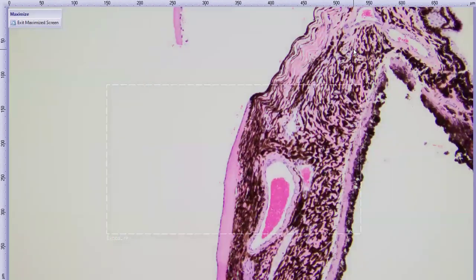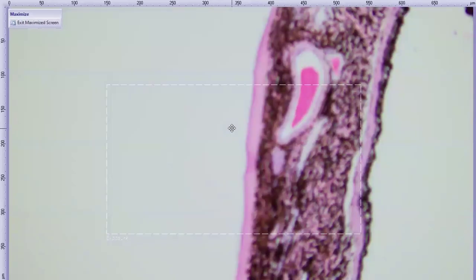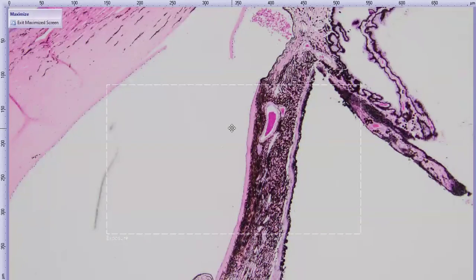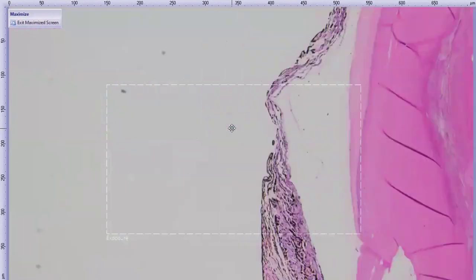So when we go a little bit more centrally, we look and see that this material is actually also basement membrane, or Descemet's membrane. And we have this nice layer of endothelium on the surface. So we have this layer of basement membrane material with what looks like endothelial cells that is essentially displaced because it's on the front of the iris and it should not be there. I don't really know what to say about the heavy iris pigmentation other than it seems to correspond to these areas that have this phenomenon.